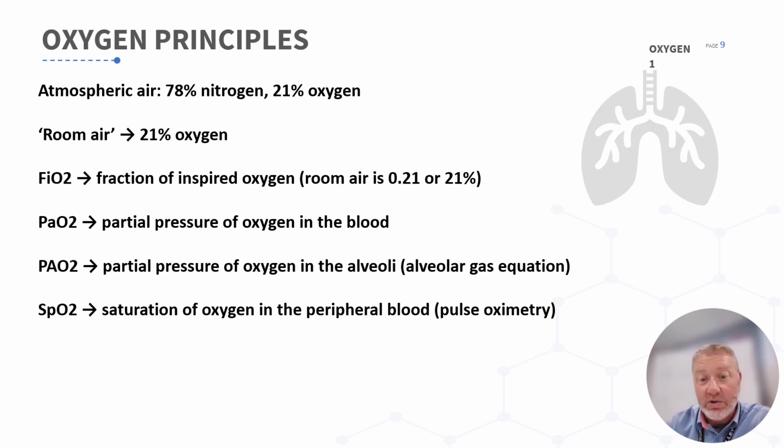And then the SpO2, that's the one that you're all used to. That's the saturation of peripheral oxygen in the blood. That is your pulse ox readout as a percentage.